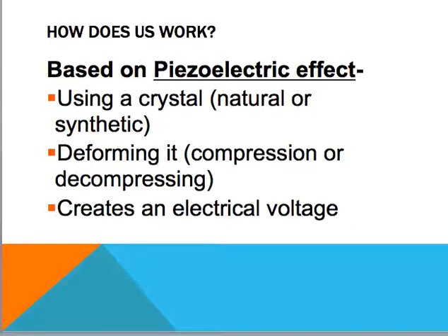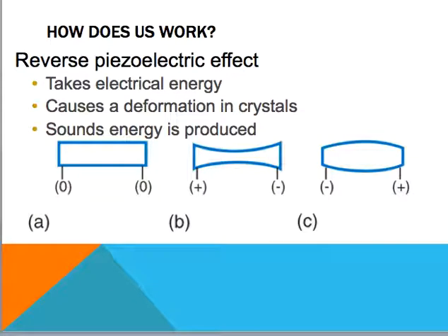And when you deform it with compression or decompression, it creates an electrical voltage. However, there is something called the reverse piezoelectric effect, and it takes electrical energy and it causes a deformation of crystals, and then sound energy is produced. So it's the piezoelectric effect just in reverse.